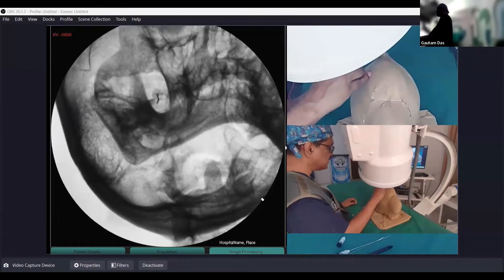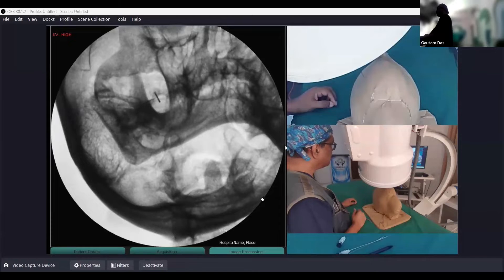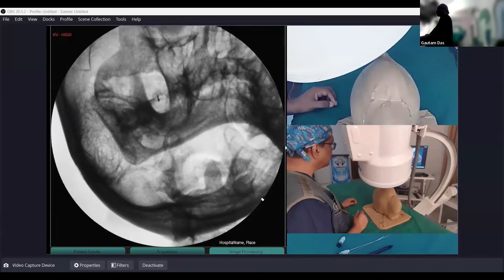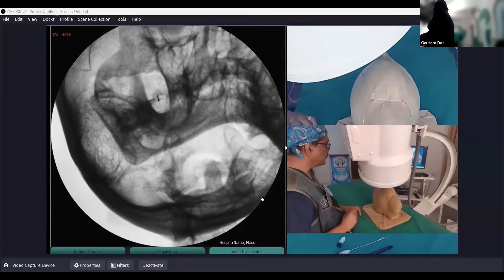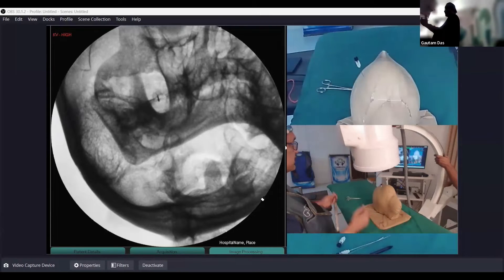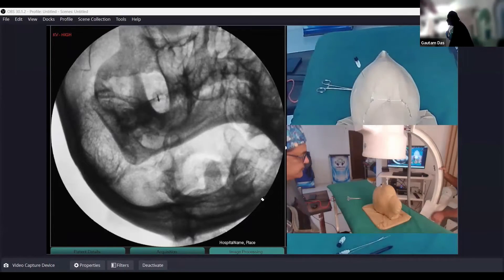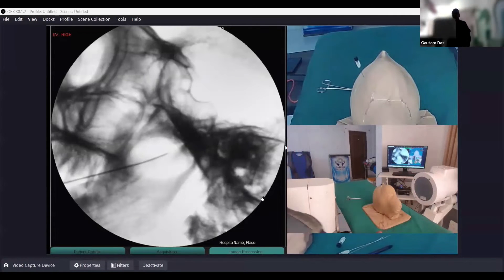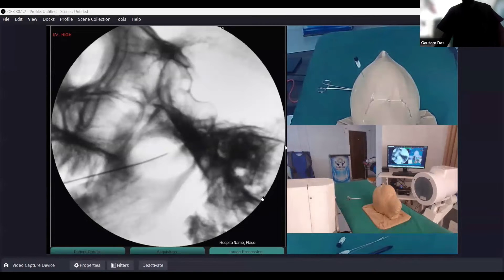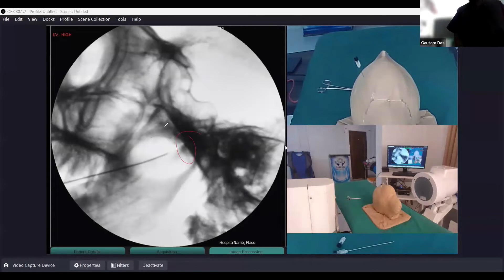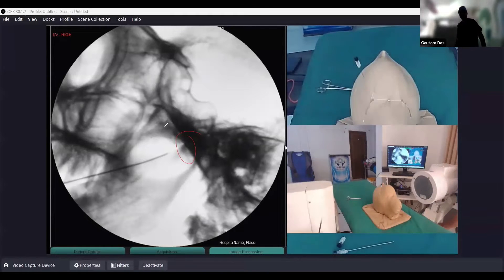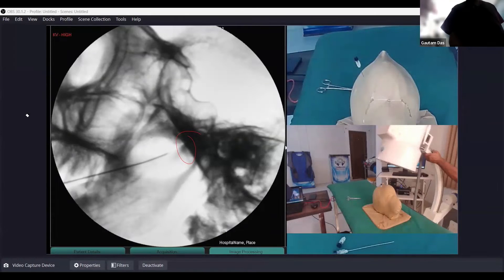Sometimes you may hit the margin of the foramen ovale, which also helps you understand your depth. Or sometimes you can go directly into the foramen ovale. When you feel you have gone deep enough, check the depth with the lateral view. If you need to advance more, go back into tunnel vision and advance. Advancement should always be done in tunnel vision.